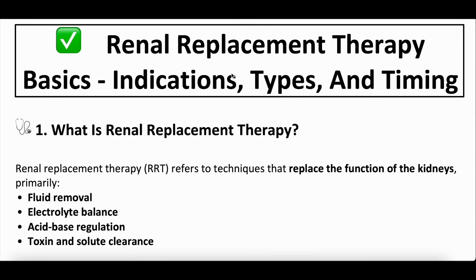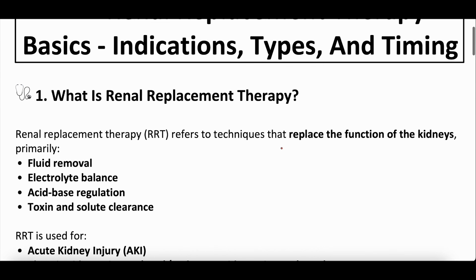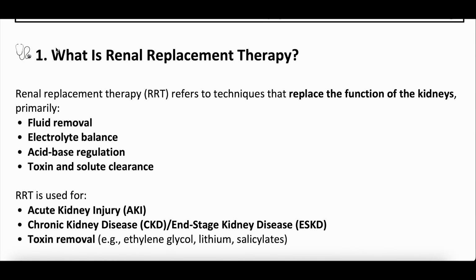Renal replacement therapy, basics, indications, types, timing, all that good stuff. So starting with, what is renal replacement therapy? When we're talking about RRT, which is not in this video the rapid response team, it is renal replacement therapy, what are we actually talking about? Well, renal replacement therapy refers to kind of the technique.